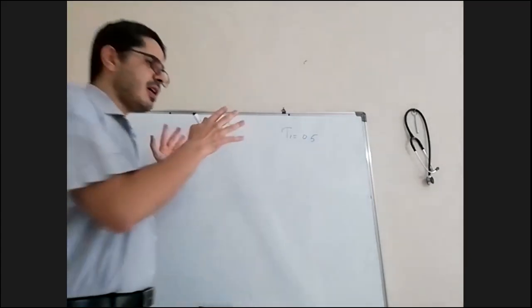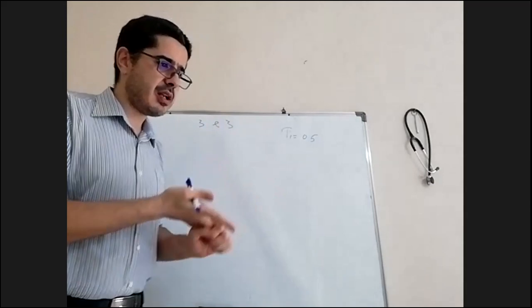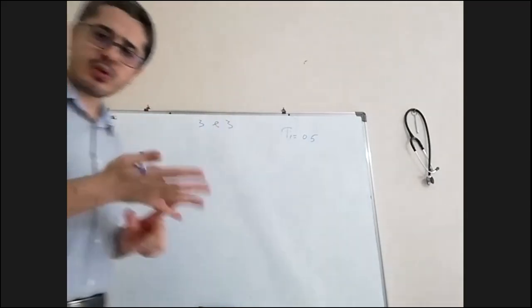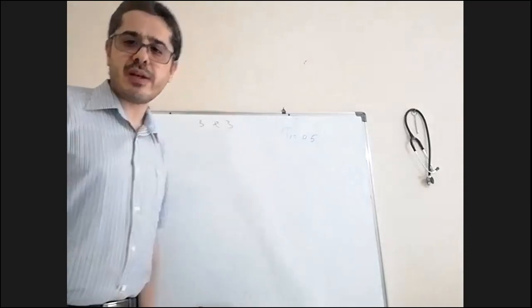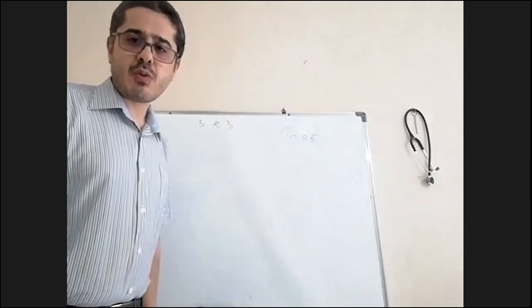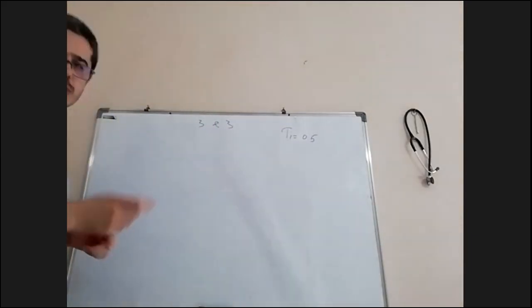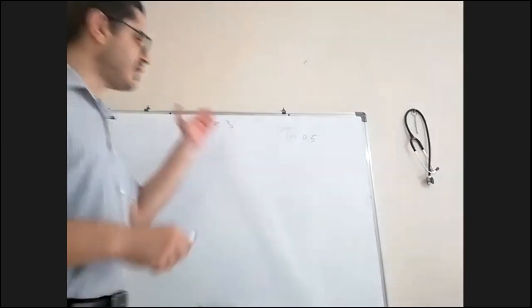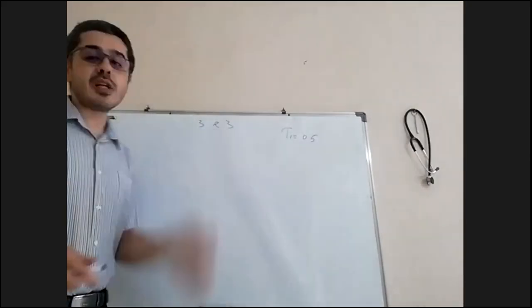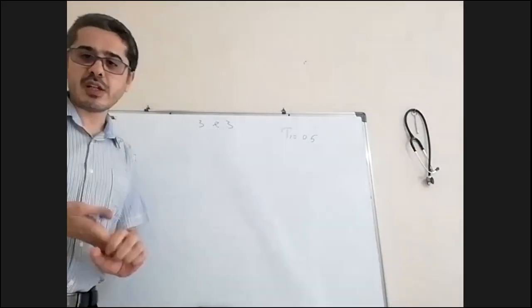So based on the three parameters, control, trigger, cycle, and the three types of breathing, controlled, assisted, and spontaneous, we can know the mode of the mechanical ventilation. What mode are we using? So let's go to the modes. You can move the slides which you have. You can see the list of modes. The problem is there is no consensus. So sometimes when you go and study in the literature, you get some confusion.